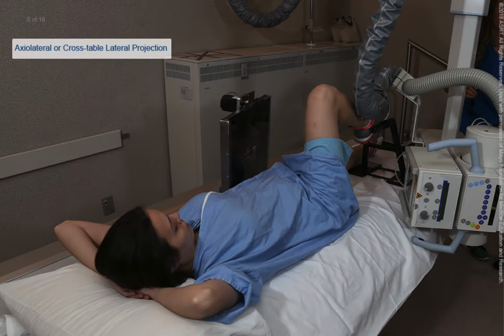The axiolateral projection of the hip using the Danelius-Miller method is more commonly referred to as a cross-table lateral or surgical lateral projection. This projection uses a horizontal central ray and can be performed if standard positioning for a lateral hip projection is contraindicated due to trauma or pathologic factors. If a patient has an implanted orthopedic device, it must be imaged in its entirety in this projection.